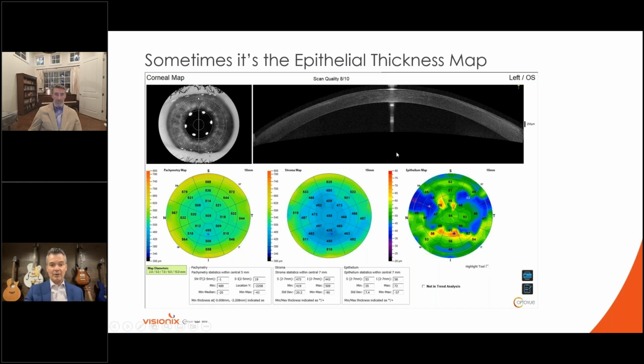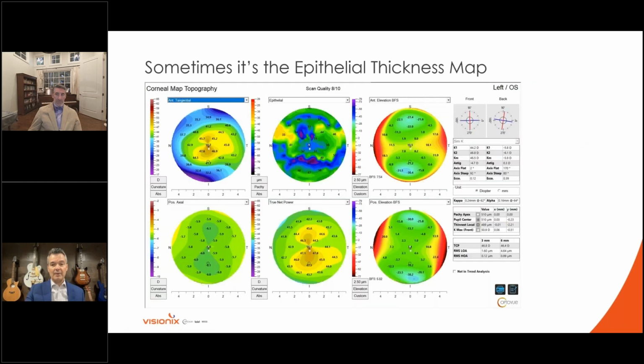And when you look at the cross-section of the actual OCT scan up here to the top left of it, you can actually see where that scar is located. Again, just left of the center of that top image. Again, to the very anterior surface, just beneath the epithelium. So again, it gives us indications of what's going on with these individuals or with these patients.